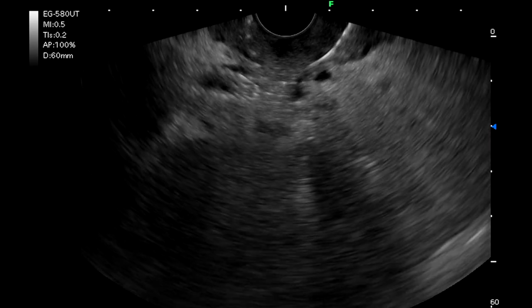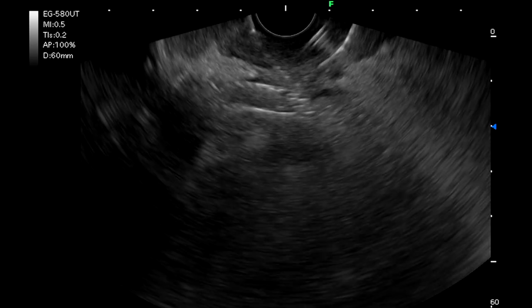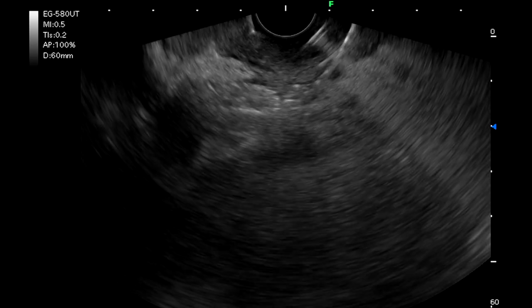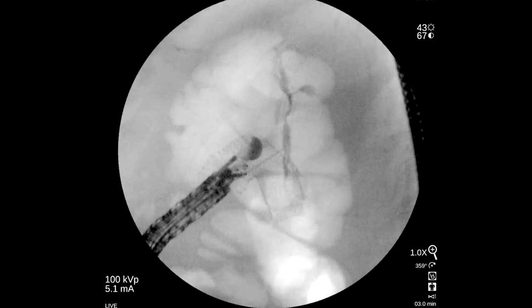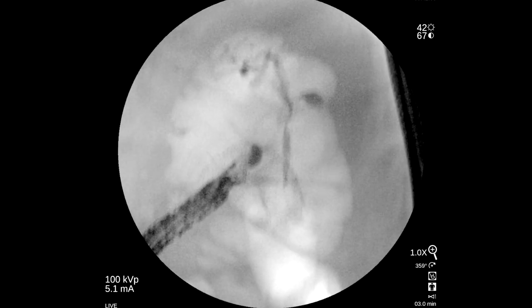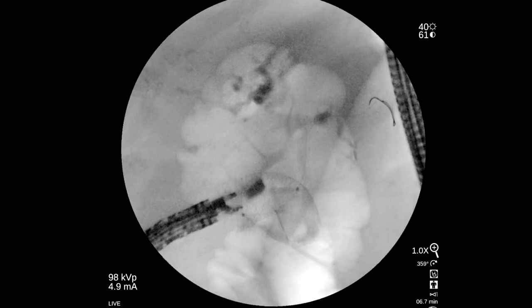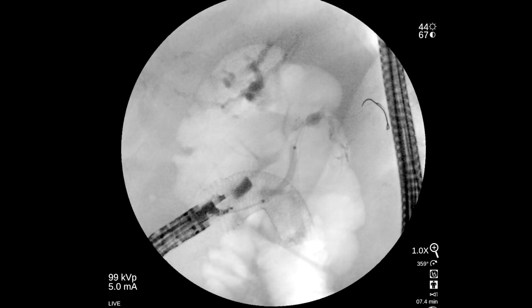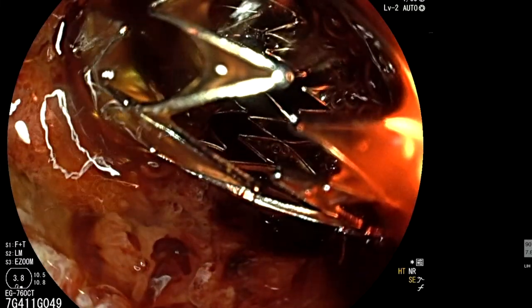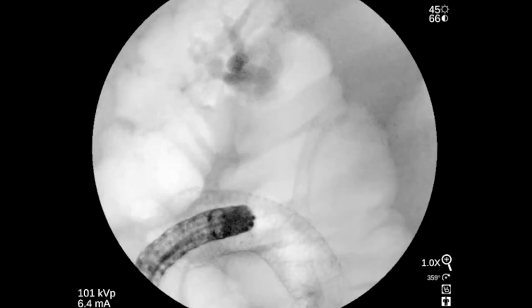At EUS, the metallic biliary stent was punctured transduodenally using a 19-gauge FNA needle and the guidewire was advanced to the intra-hepatic bile duct. The short, rigid tip of the echoendoscope enabled easy manoeuvrability in the duodenum. The transduodenal tract and the metal stent sheath were dilated to 6mm using a hurricane balloon, and a 6mm by 6cm epic uncovered metal biliary stent was deployed successfully for biliary decompression.